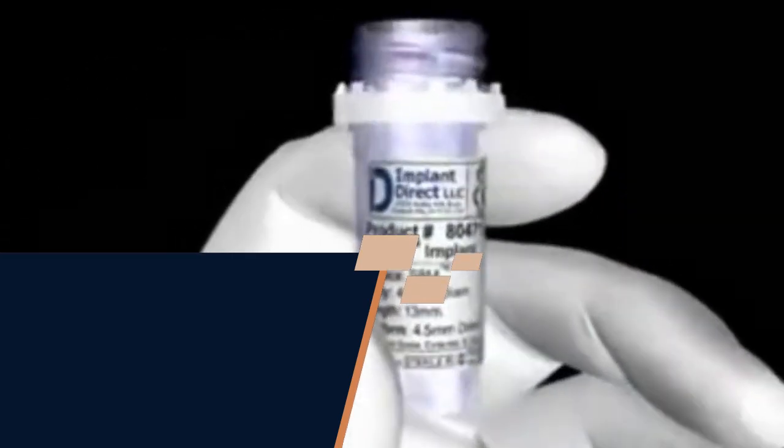Implant placement. During this surgical phase, the dental implant is placed into the jawbone. The dentist or oral surgeon makes an incision in the gum tissue to expose the underlying bone, drills a small hole, and carefully inserts the implant. The gum tissue is then stitched back in place.